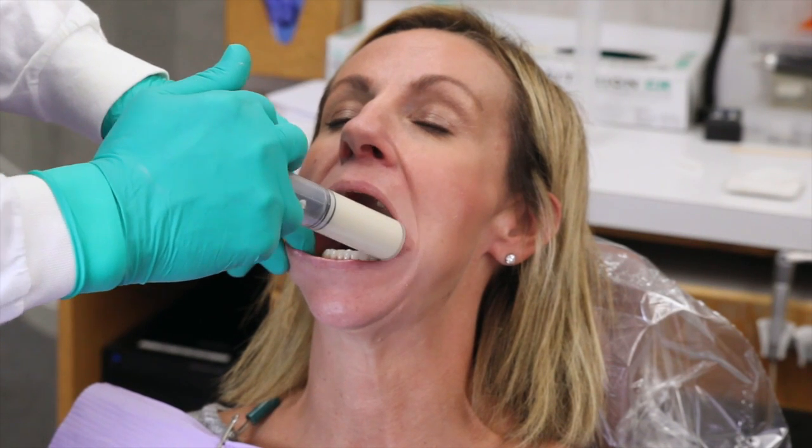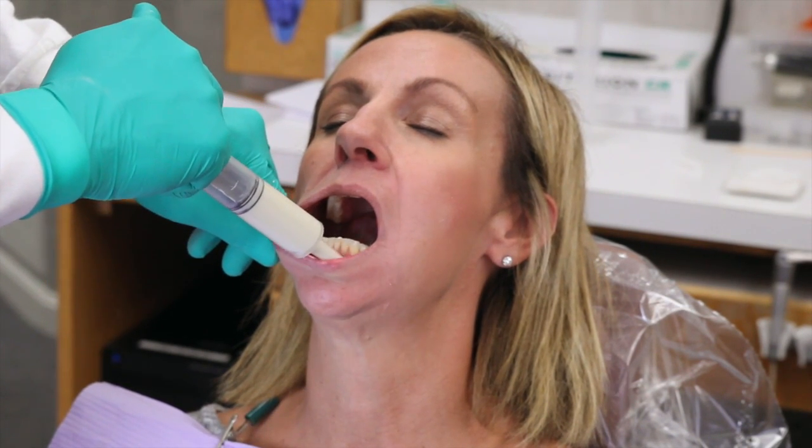So, as we're speaking here, Donna's mixing the low viscosity injection alginate and loading the tray. And again, if Debbie were very, very wet, very juicy, so to speak, we would also have the cotton in there. But she's not. She's very typical, and because of the hydrophilic nature of alginate, unless someone's really, really juicy, that's really not necessary. So we have the injection ready here, and in just a few moments after Donna's about halfway through mixing the high viscosity, lower takes a little longer to inject, so I'm going to go ahead and begin. And we're going to begin on the buccal vestibule, starting most posteriorly, coming around.